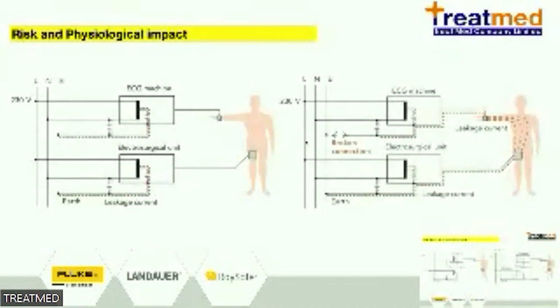This is the risk when we use more than one medical device. In the picture is a complete system of medical devices.